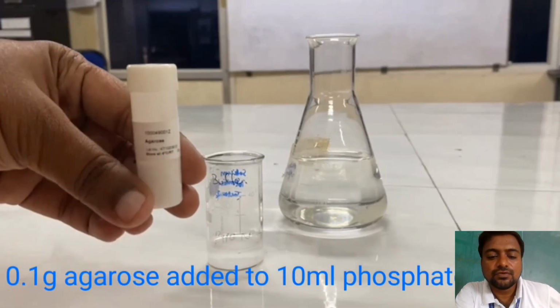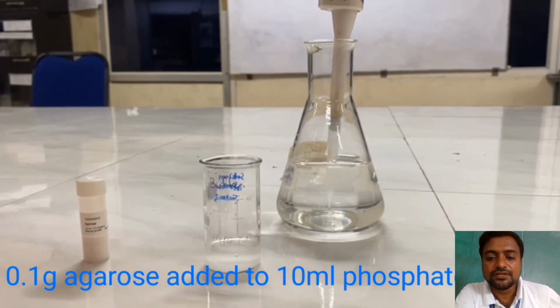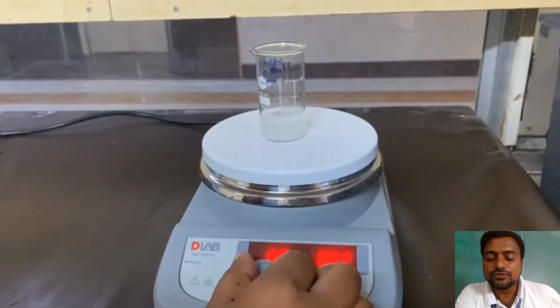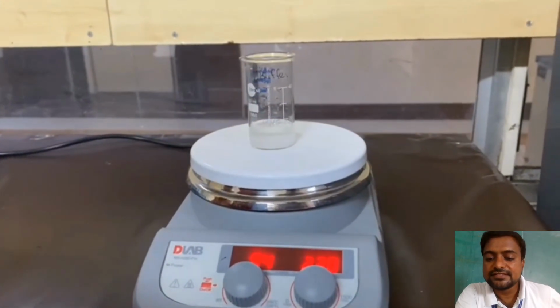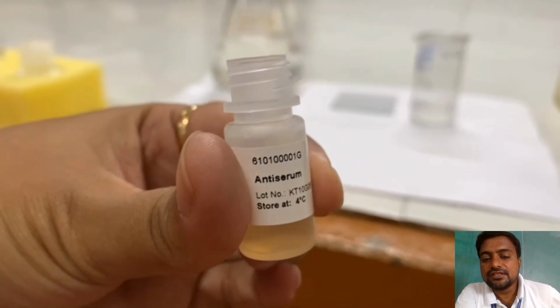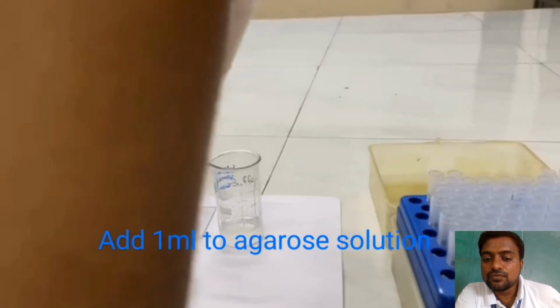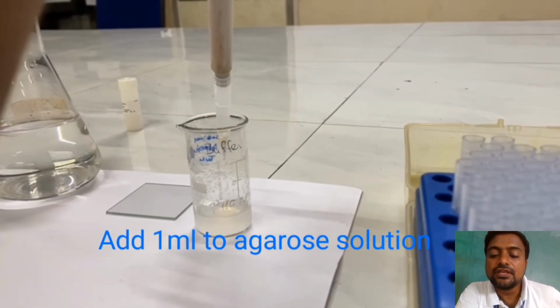Now, 0.1 gram agarose is taken and added to 10 ml phosphate buffer. We take this solution and ensure that it is heated, as is the general procedure. Once the agarose solution is heated and cooled, it's time to add 1 ml of the antibody to the prepared agarose solution.